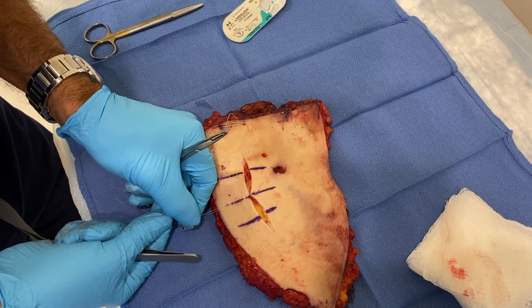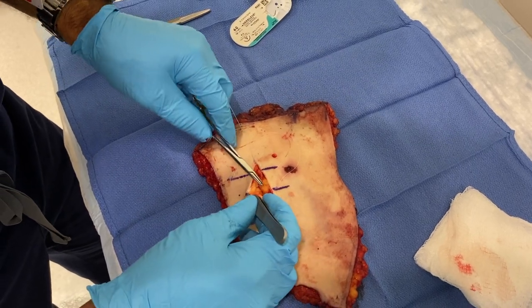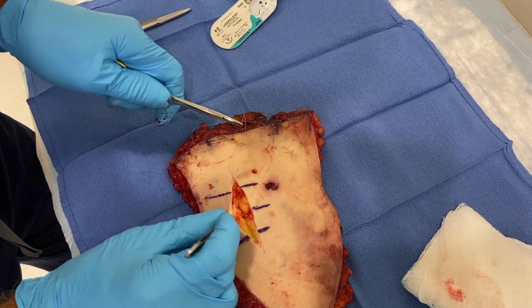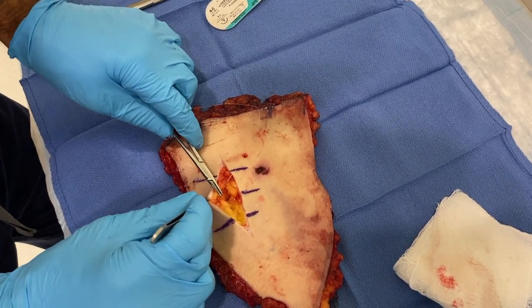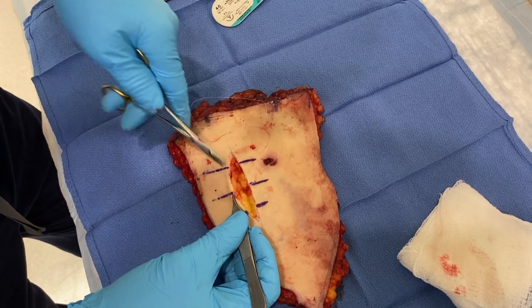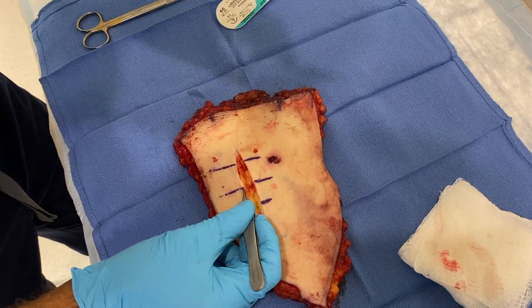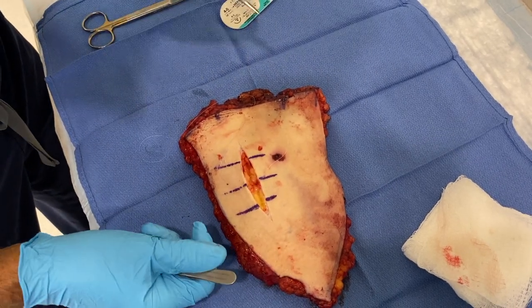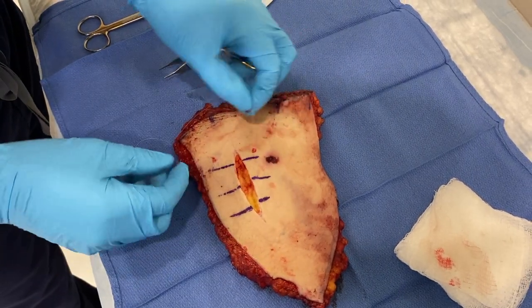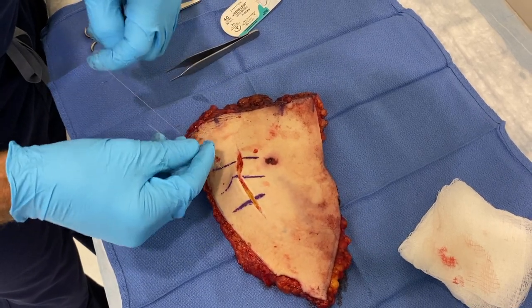We can see where we need to go. Right at our hash mark, we're going to pick up the suture again and do it in reverse. We're going to pick up the tissue by the dermis and go in deep to get a nice square purchase, so that we have the same amount of tissue in our stitch on this side as on the other side. Then we're going to do a tie.